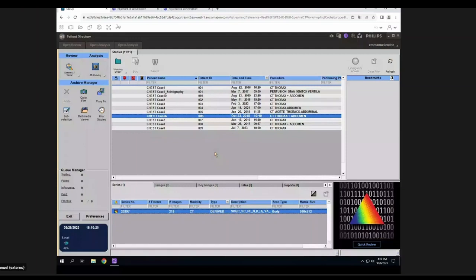It can work in some cases. Sometimes it doesn't work. In the present case, it doesn't work. So we don't use it in clinical routine. We don't know exactly what is the background of the calcium suppression. Maybe we have to do some experimentation with cadavers to see if there is a blood component, or we don't know exactly. So we don't use it in routine.